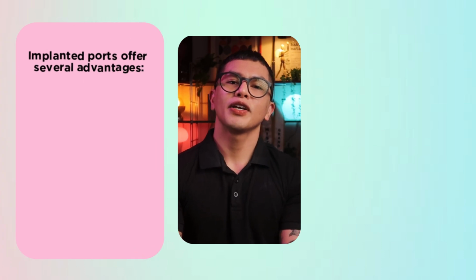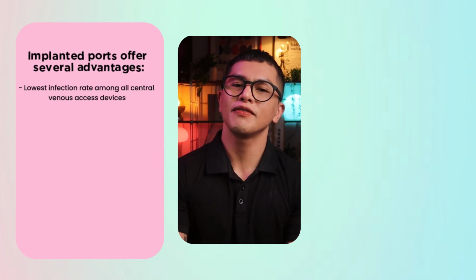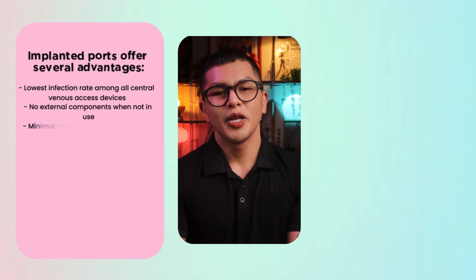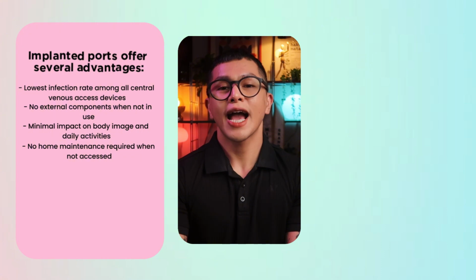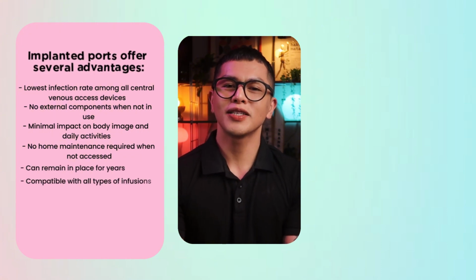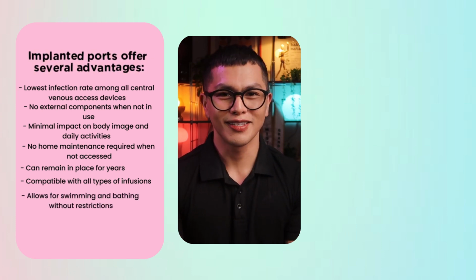Implanted ports offer several advantages: lowest infection rate among all central venous access devices, no external components when not in use, minimal impact on body image and daily activities, no home maintenance required when not accessed, can remain in place for years, compatible with all types of infusions, allow for swimming and bathing without restrictions.